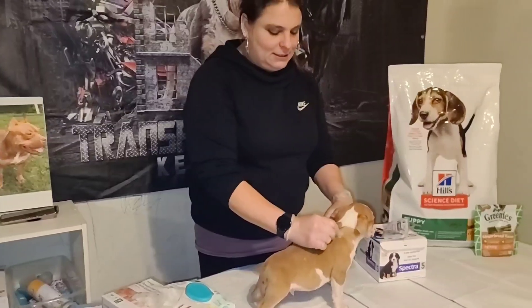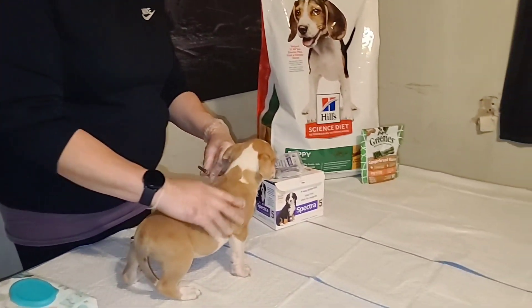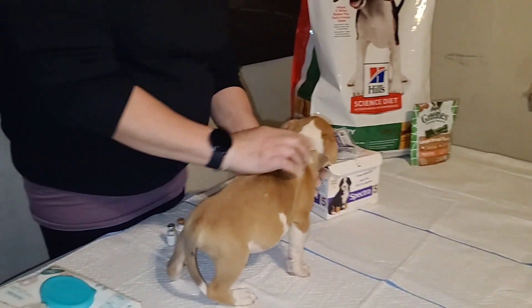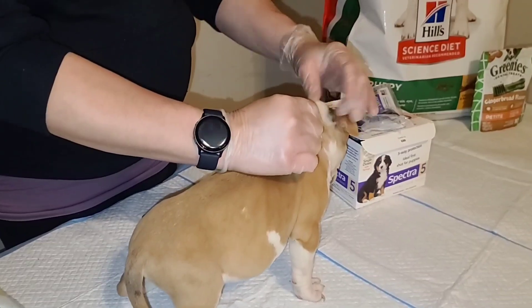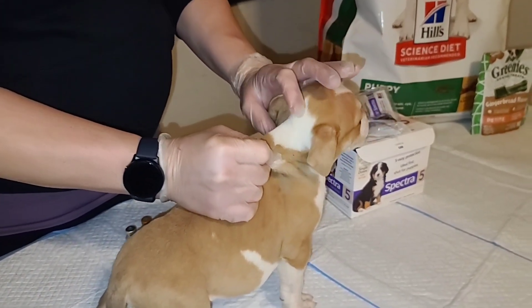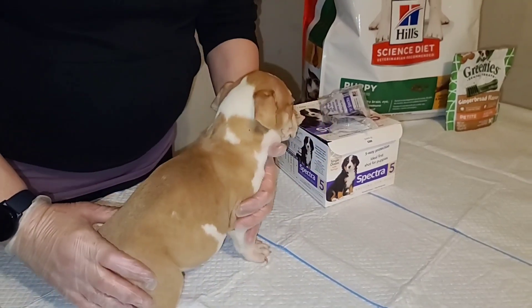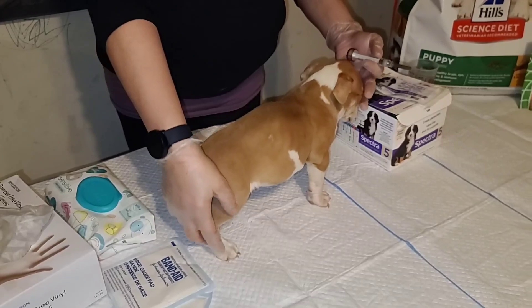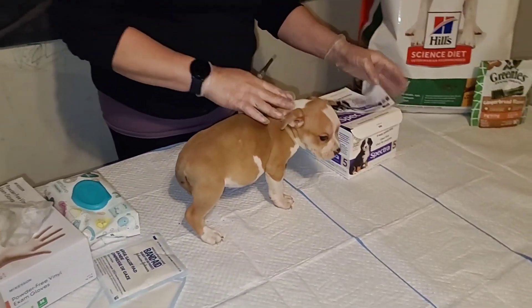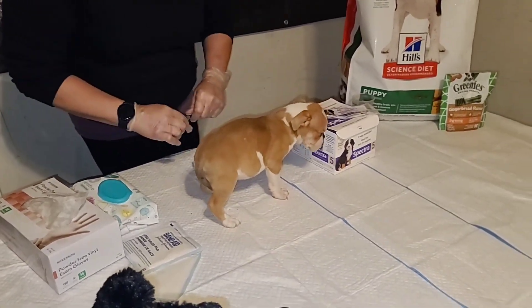You want to go in the skin — it's a subcutaneous injection, it's not going into the muscle. On this guy we're going to do his injection right here on his skin and just pull it up like a tent. You're going to go in the middle right into the skin. You do not need to use alcohol pads on puppies.